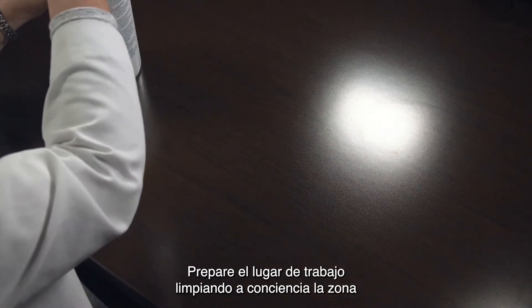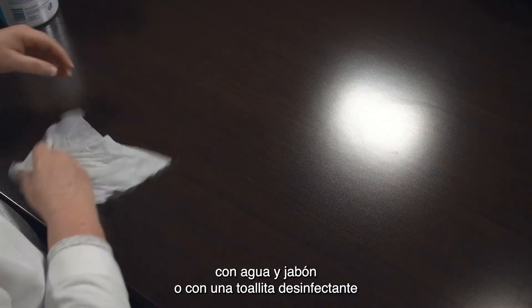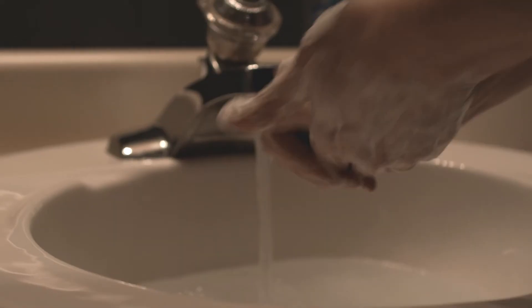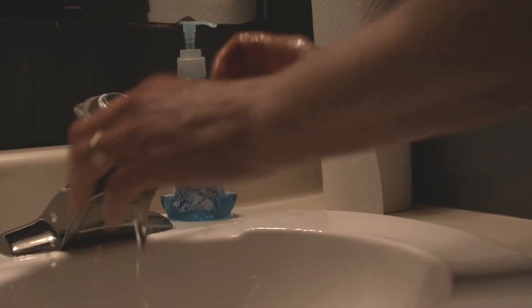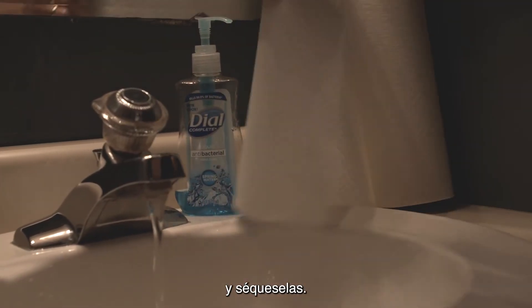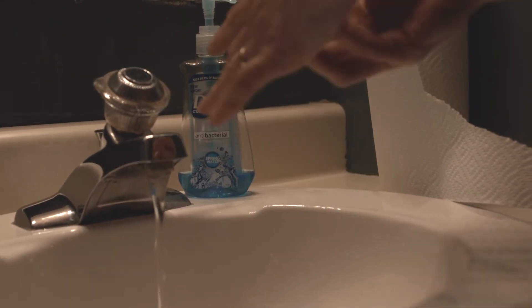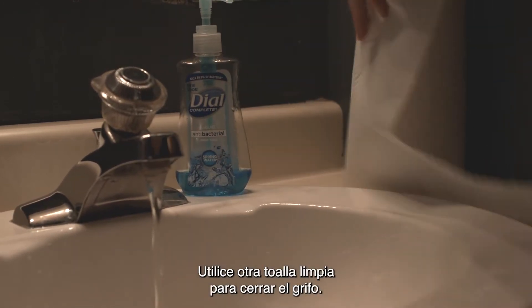Please begin by preparing your work surface by cleaning the area thoroughly with soap and water or a disinfectant wipe, and drying thoroughly as well. Wash your hands thoroughly for at least 20 seconds, and then dry your hands. Use a separate towel to turn the faucet off.